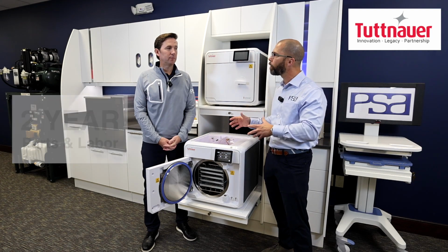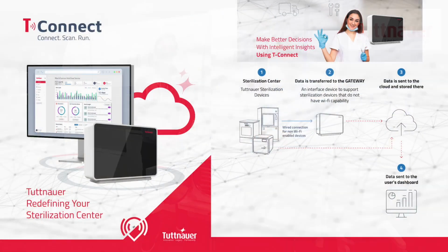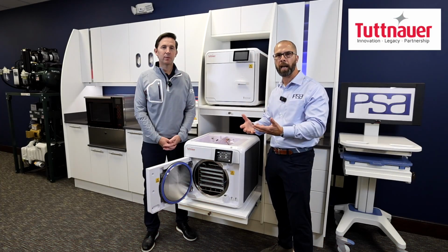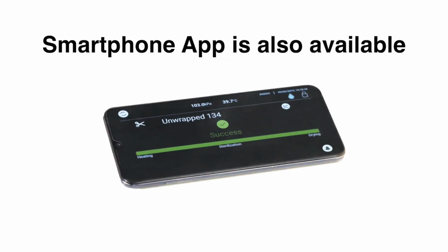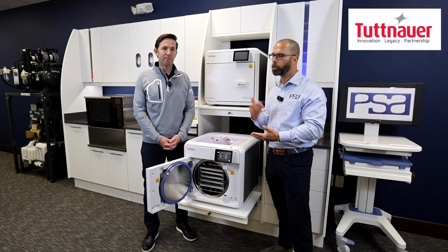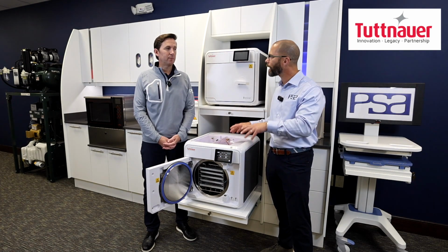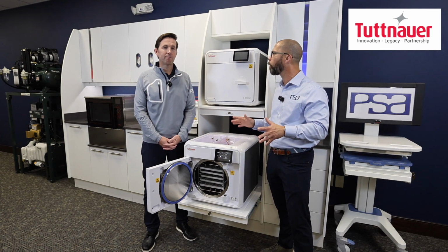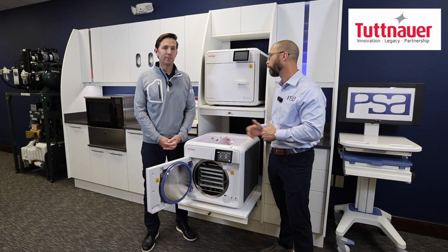When you couple that with our exclusive T-Connect capabilities, which basically means the moment this gets turned on, this unit is capable of communicating through the Wi-Fi in the office, so that we can monitor the maintenance, any error codes, and serviceability for the service providers, the dental dealer, the doctor, or our technicians. So we're backing this with the best support that could possibly be provided in the dental field of sterilizers.